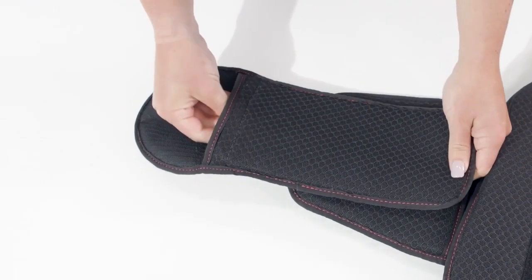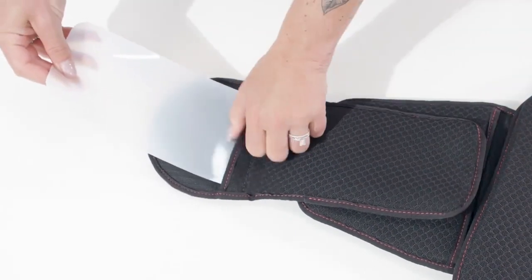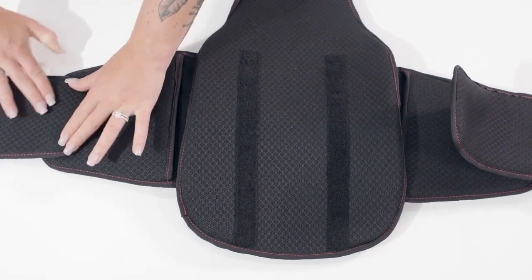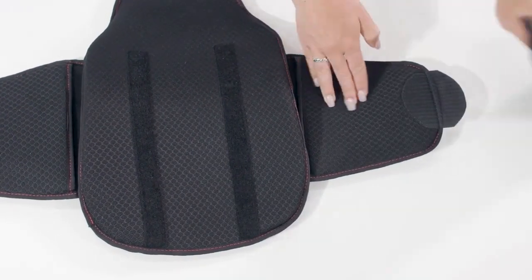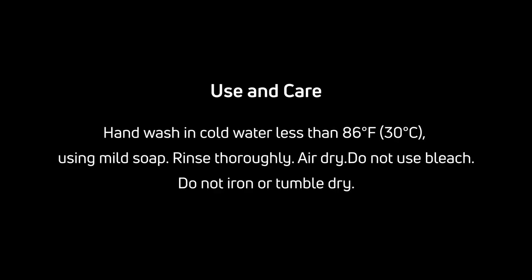To insert or remove the front belt panel, open the inside panel pocket and insert or remove the semi-rigid panel. If a patient experiences post-surgical swelling followed by weight loss, the TLSO brace is designed with two adjustable belts which can be easily sized to achieve optimal fit. Only the sock goods can be cleaned; before cleaning, remove the rear panel.